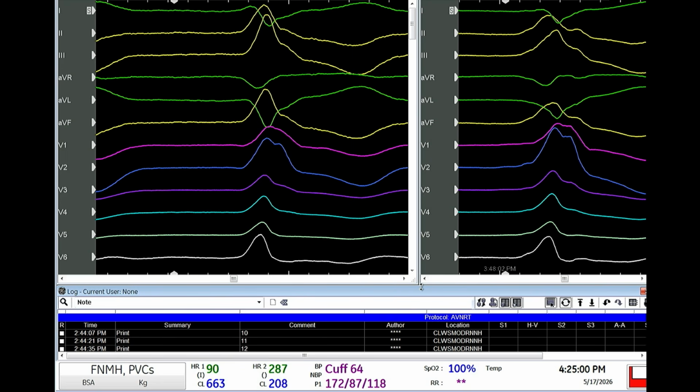But as soon as you start coming towards the right-left junction, V1 should be more negative. Now, there's, of course, a big variation. There's not a single EKG. So what strategy will we follow? Well, the strategy is based on the history of the patient. This is a patient that has PVCs that look a little bit wider, that might not be typical for an endocardial site, but perhaps the first one is. But these are more than one morphology, but in my opinion, very close to each other.